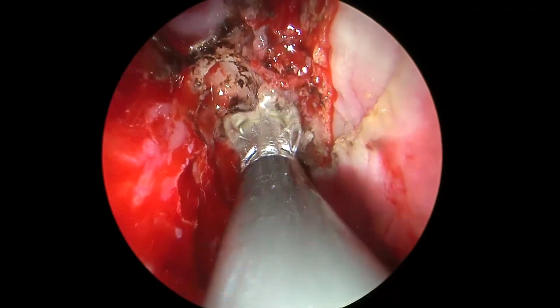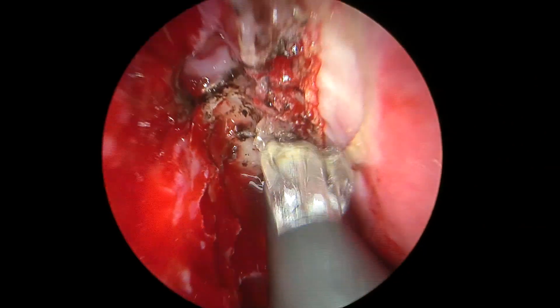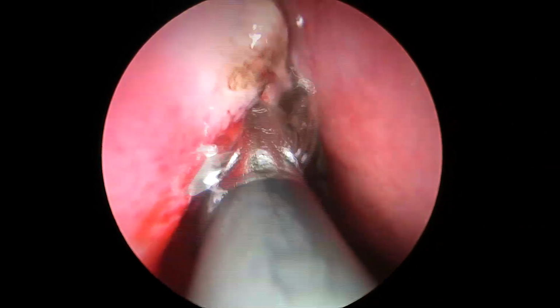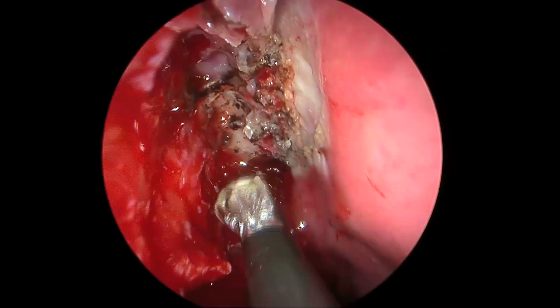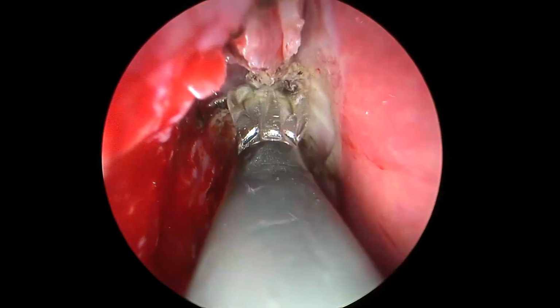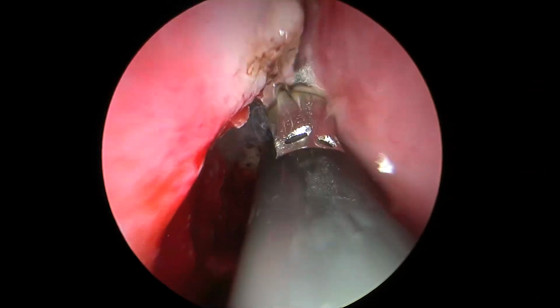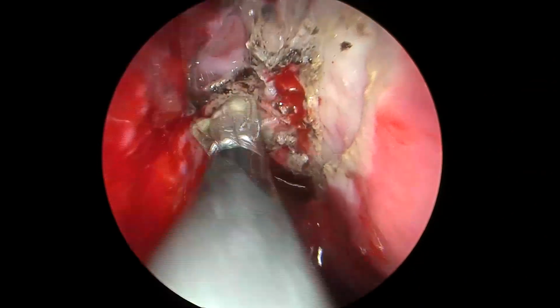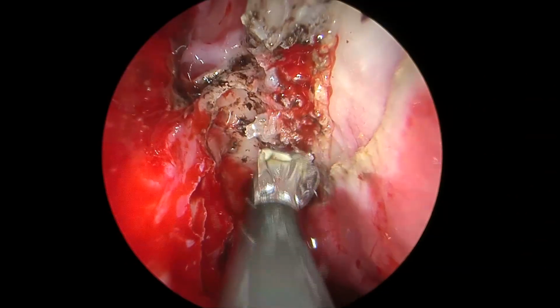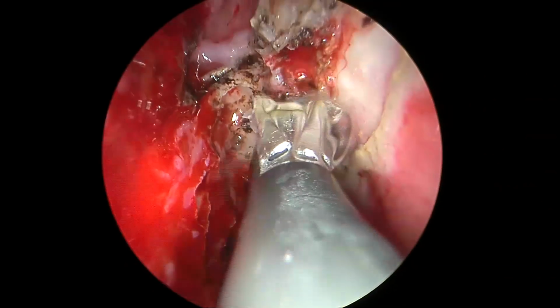So one must not shy away from ablating a reasonable amount of mucosa in all these regions. And once you have done that and you have coagulated the meningocele, you can very well ablate it as well, so as to be able to locate and isolate the defect very nicely for it to be repaired. Our goal here is to use 3 layers, which is the fat, the fascia, and the mucosa as a free mucosal graft from the harvested middle turbinate.